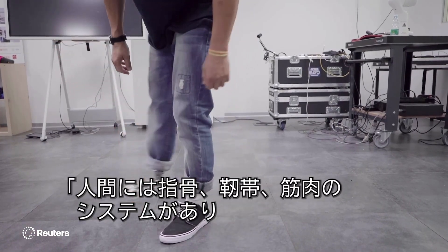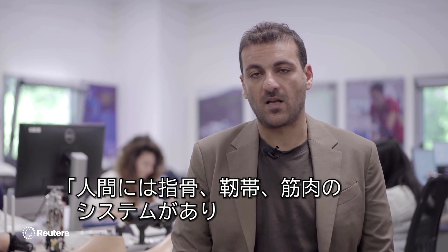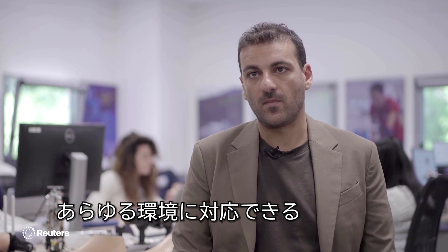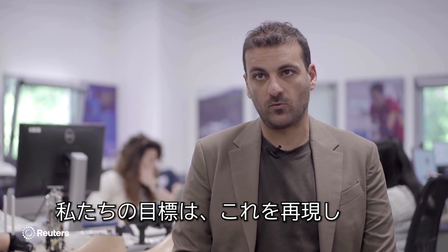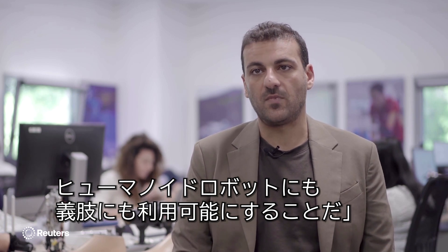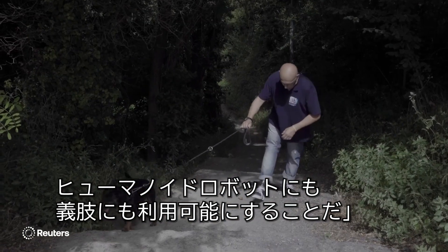We have a system of phalanx, bones, ligaments and muscles that allow us to deal with every kind of environment. What we are trying to do is to replicate this — to translate this principle into a technology system that can be available for both humanoid robots and also prosthetic systems for humans.